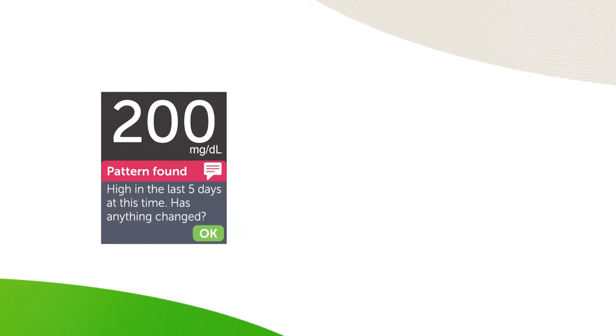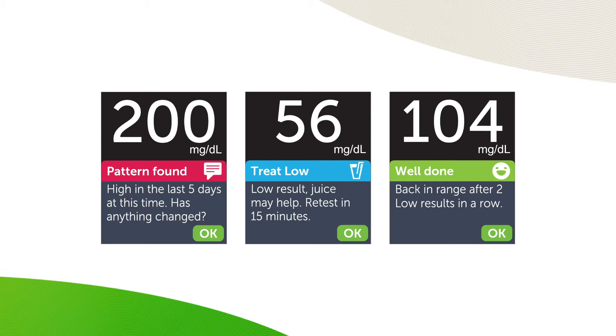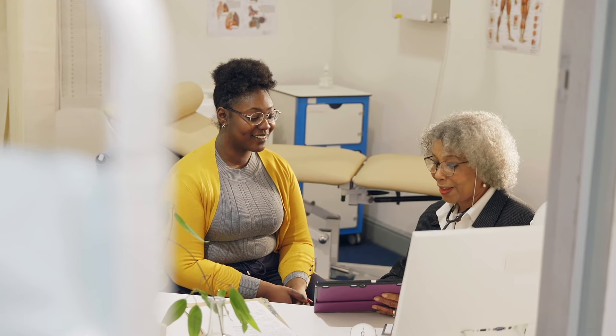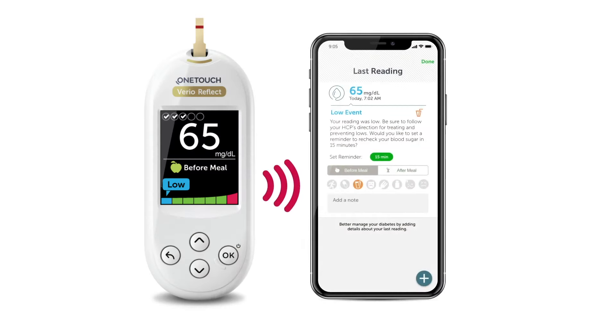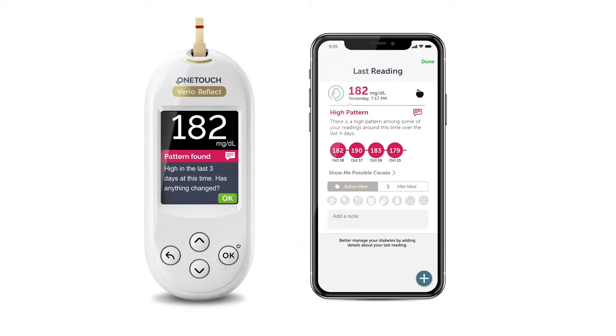The Blood Sugar Mentor feature on the OneTouch Verio Reflect meter provides personalized messages based on your results, giving you real-time guidance, insights, and encouragement. This meter can be a helpful tool as you work with your healthcare provider to understand and manage your diabetes. The OneTouch Verio Reflect meter also syncs with the OneTouch Reveal mobile app, which gives you more guidance and insights to help manage high and low blood sugar patterns.